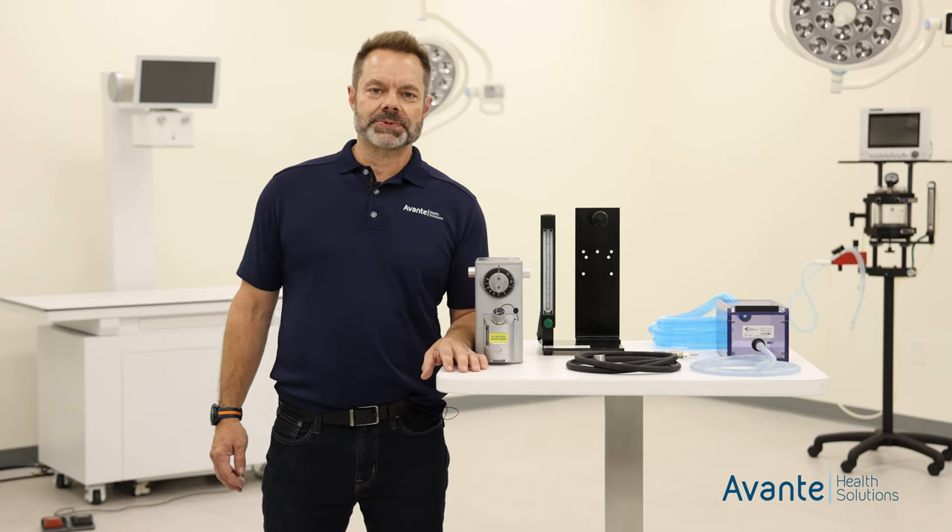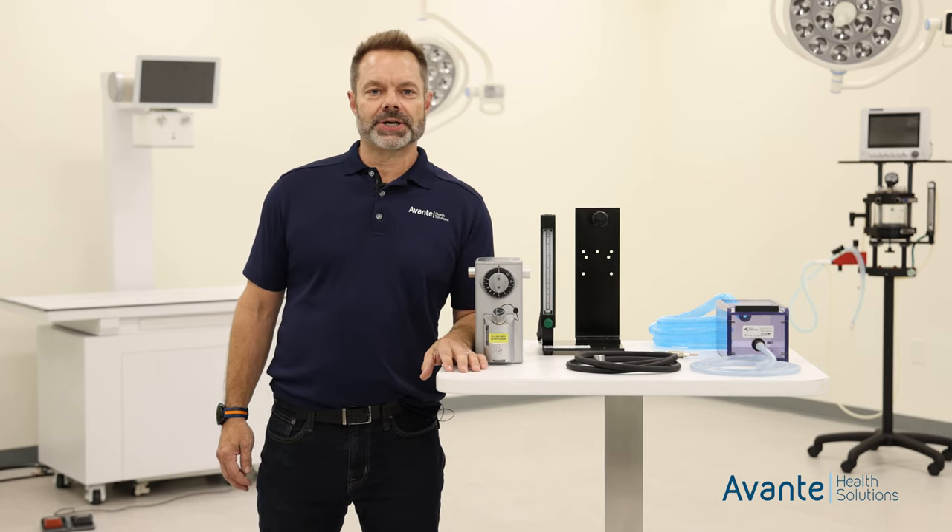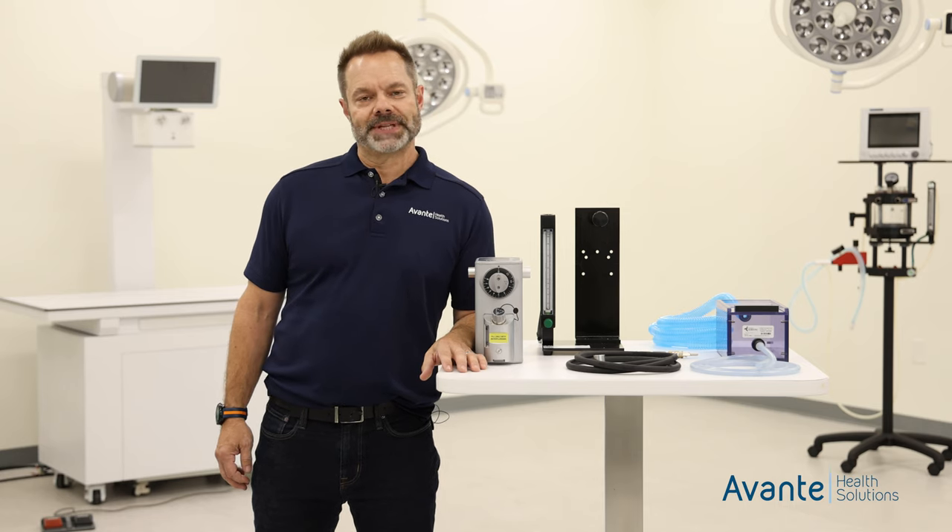That's our Compact Mini anesthesia machine. If you have any questions, please contact your Avanti Animal Health sales rep. Thank you.